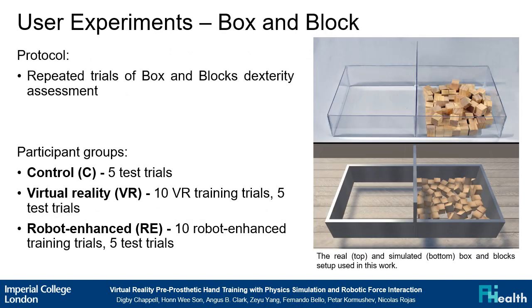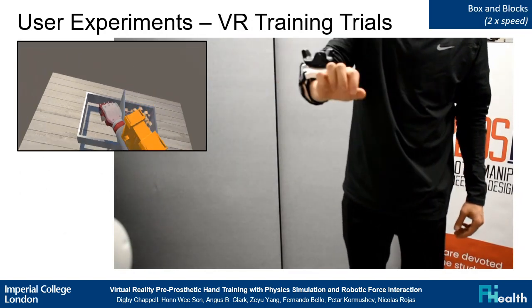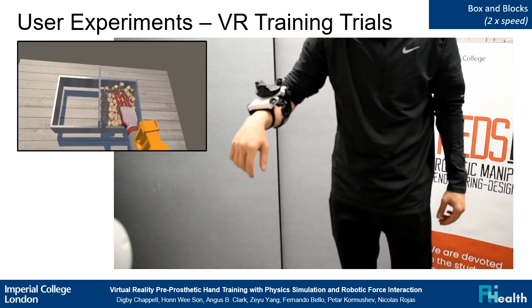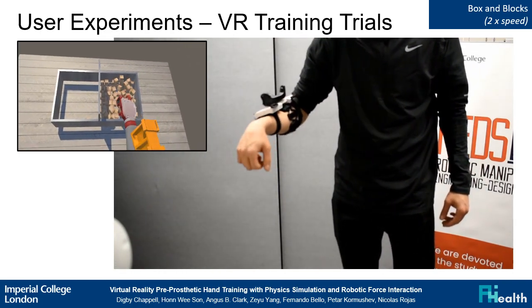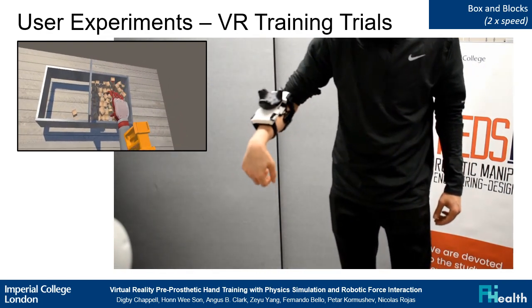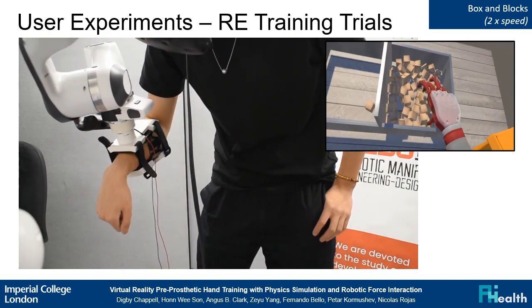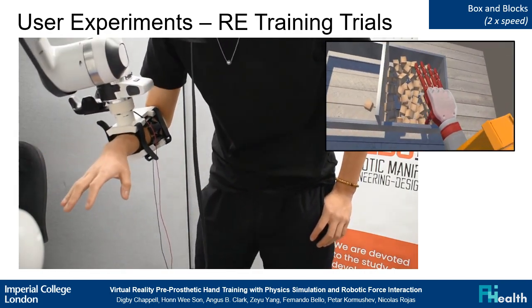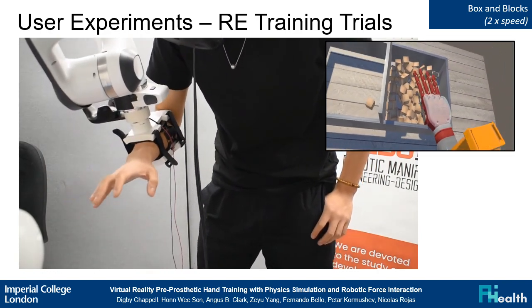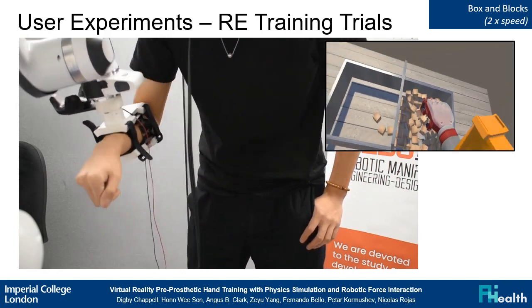The first experiment performed was the box and blocks test. Ten training trials were performed and five test trials. Each group contained five participants. Here we see a participant of the VR group performing training trials. The user has no force feedback and cannot feel the weight or reaction forces of the prosthetic hand. This video shows a participant of the RE group performing training trials. This time, the user has force feedback and is able to feel the weight and reaction forces of the prosthetic hand at the attachment point of the prosthesis on their forearm.